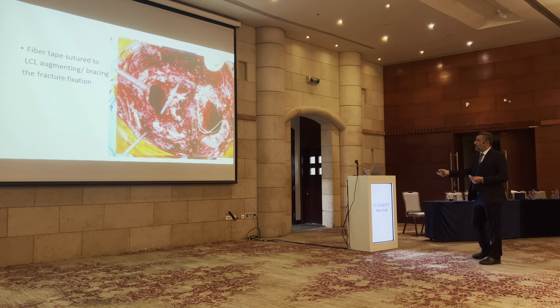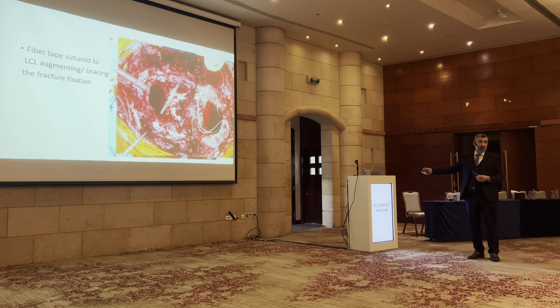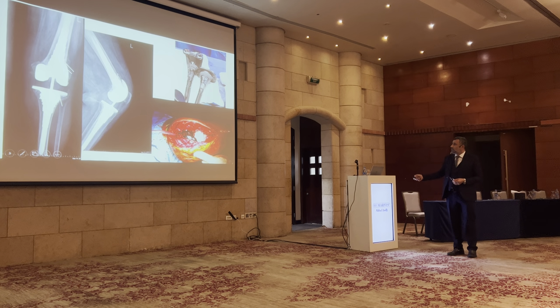The same for the patellar tendon. We were afraid about avulsion. So we brought these sutures behind the implant and passed the sutures and sutured the patellar tendon, so it will act as an internal brace. So this is, you see, we want the rotating one here. This is the sleeve system.